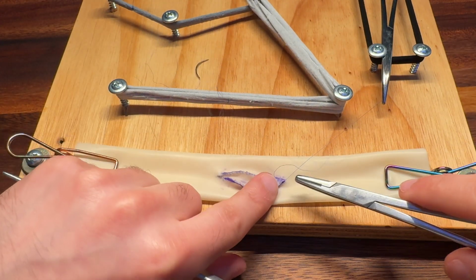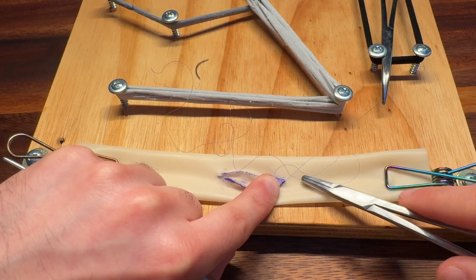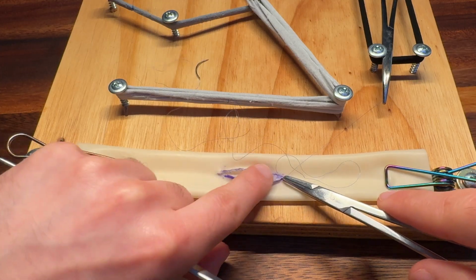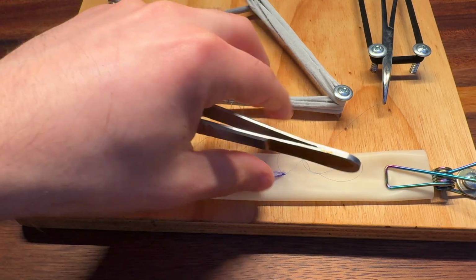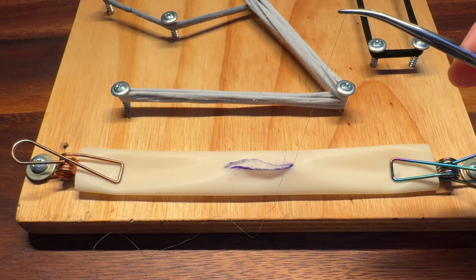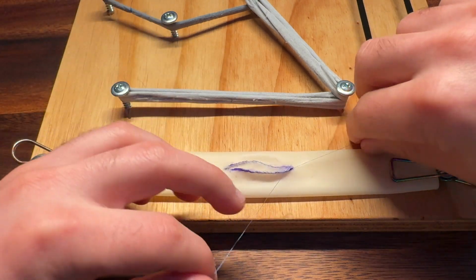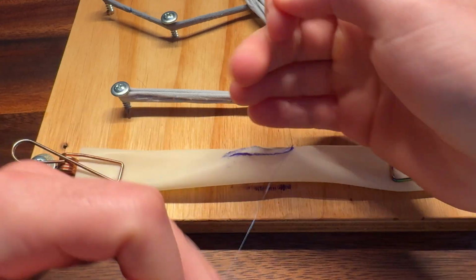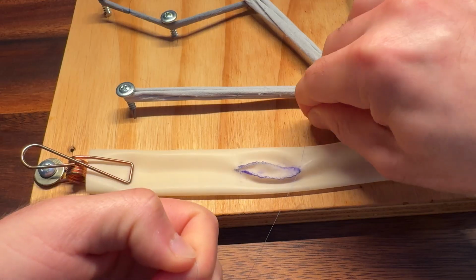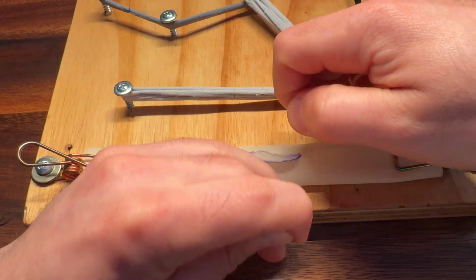Alright, so I think this is a pretty good stopping point because I'm right across on the other side from the original incision, which was on the blood vessel side, and now I came out through the patch side. So at this point, you can go ahead and let go of this, or you can keep it connected. Essentially, we're just going to do some knots. You can do instrument ties, you can do hand ties, whatever you find the most comfortable.